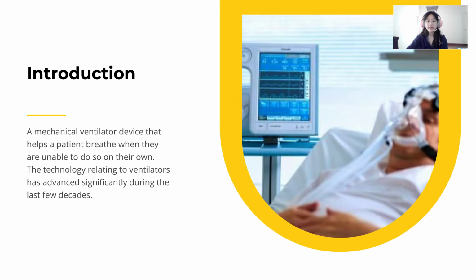First, a ventilator is a device that helps patients to breathe when they are unable to do so on their own. The technology related to ventilators has advanced significantly during the last few decades. Nowadays, ventilators play a very important role in the treatment of almost all severe diseases, as most of the patients in those conditions will have difficulty in breathing.